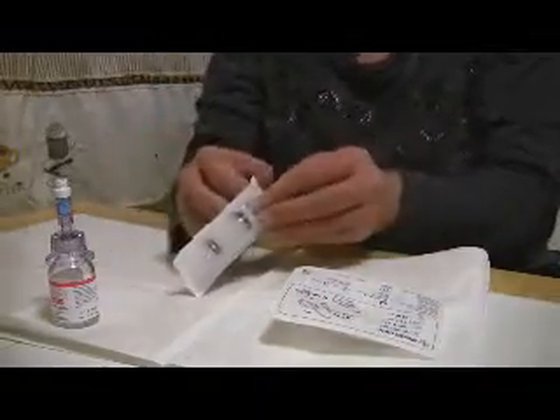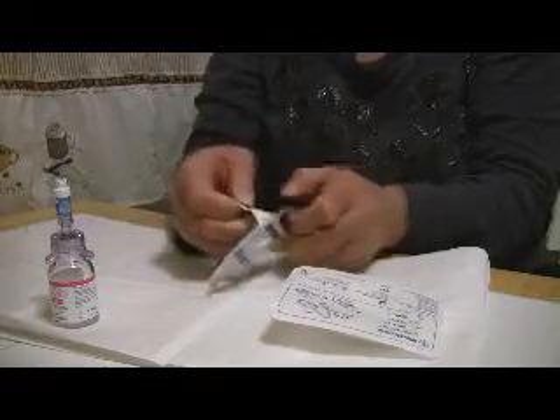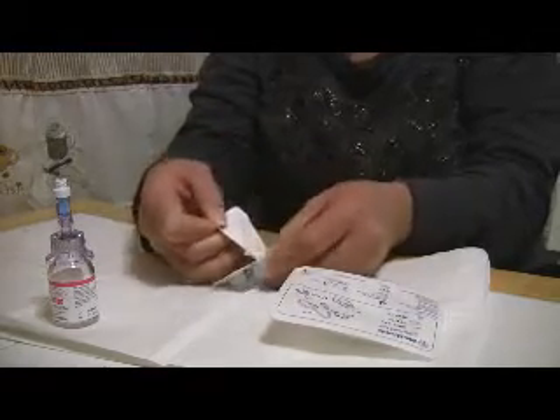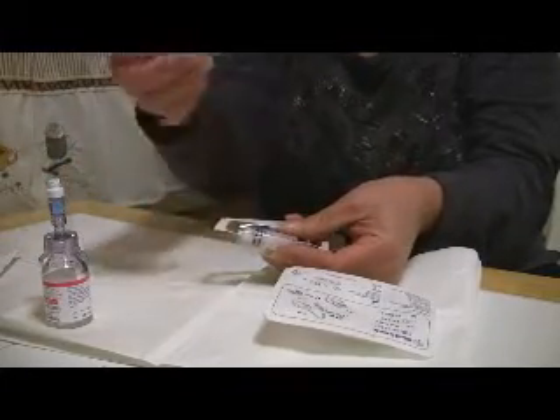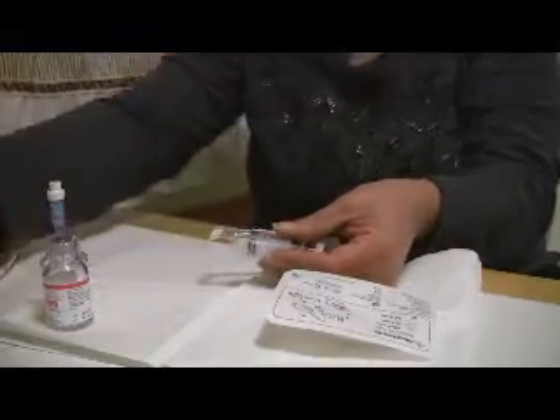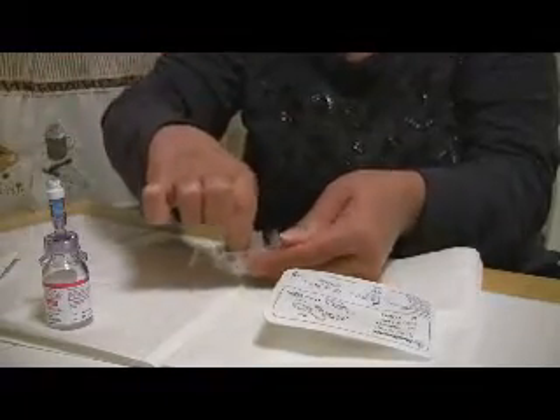The first thing we need to do is open the cassette, and we can go ahead and get rid of this needle because this needle is not necessary for the process. We go ahead and take the syringe out.